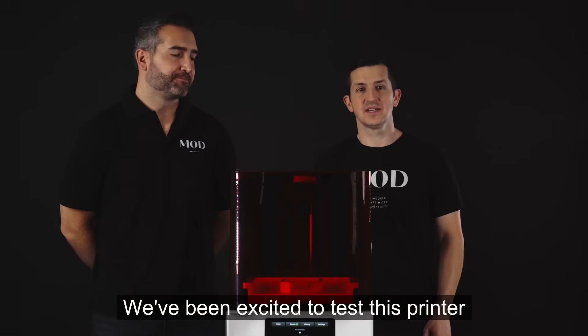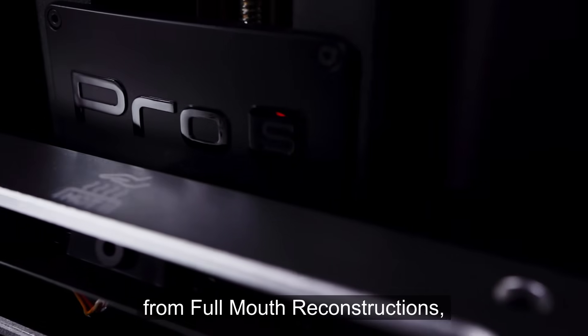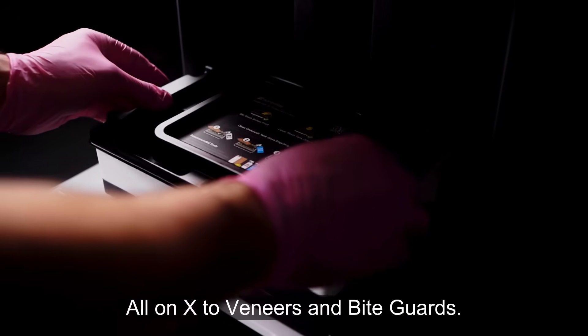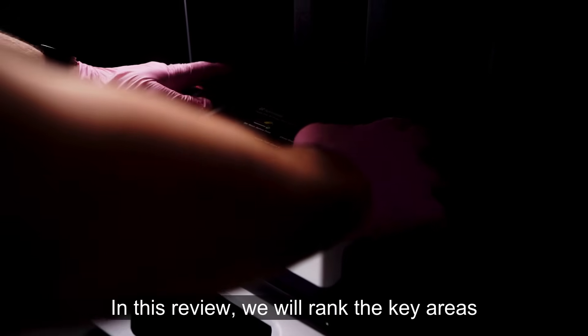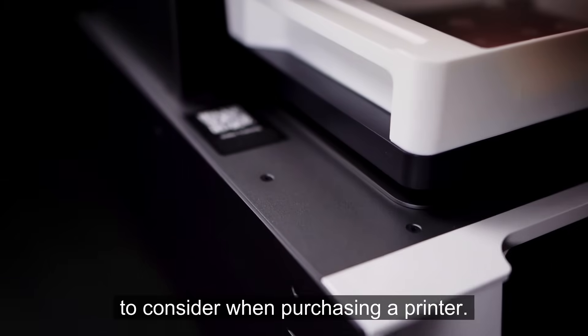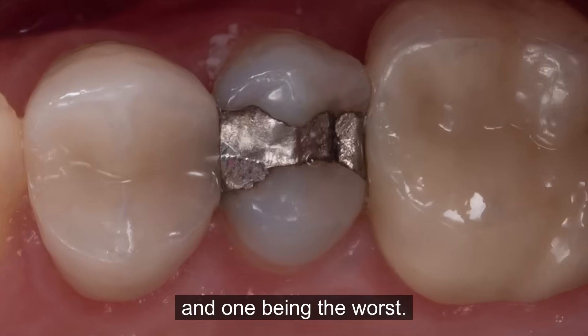We've been excited to test this printer and have been putting it through the paces in our practice. We've done a lot of cases from full mouth reconstructions, All-on-X, to veneers and bite guards. In this review, we will rank the key areas that we feel are important for you to consider when purchasing a printer. The rankings are on a scale of 1 to 5, with 5 being the best and 1 being the worst.